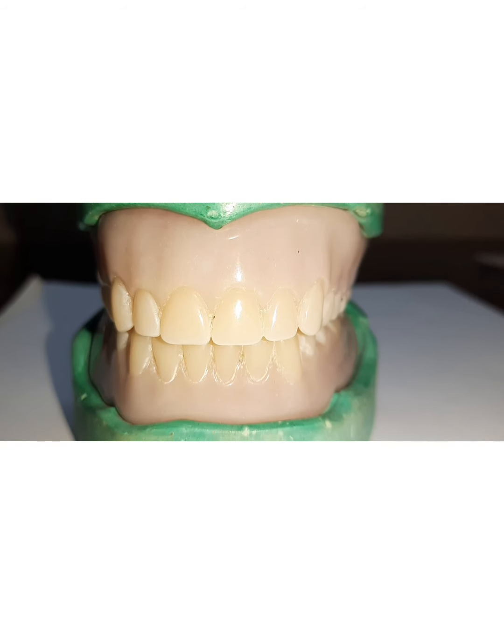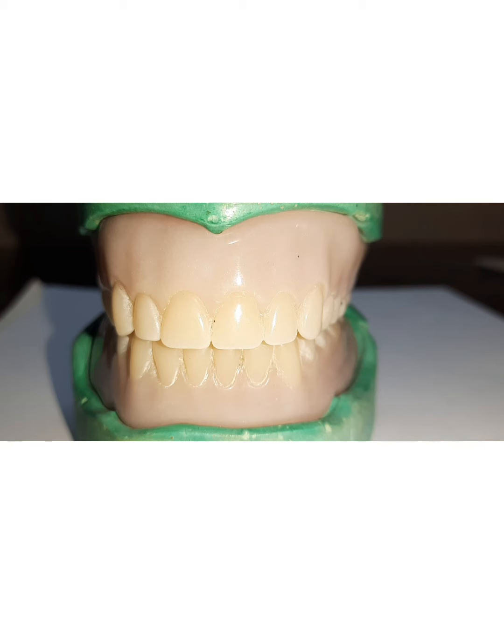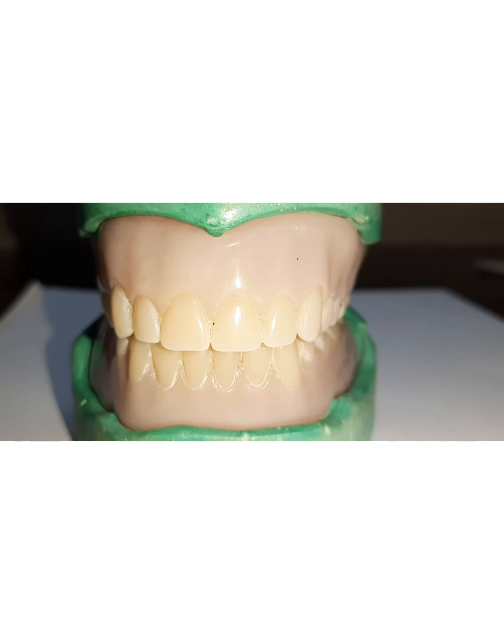Now, when we talk about a complete denture patient, we often see in clinical practice a patient who has lost all his upper and lower teeth, and we call such a patient completely edentulous. As we know, loss of teeth in a patient can cause psychological, aesthetic and functional impairment, and there is always a need to restore and replace the missing teeth and adjacent structures with an artificial substitute to allow the patient to function and lead a normal life.